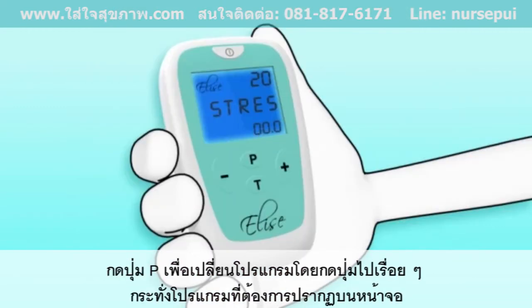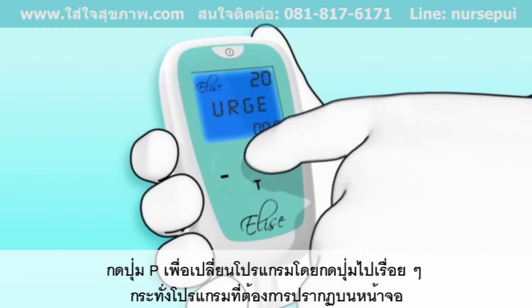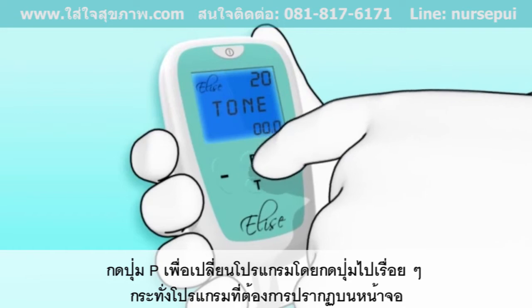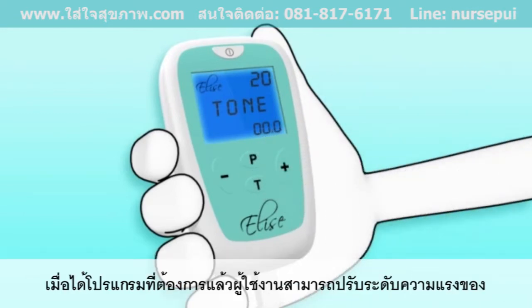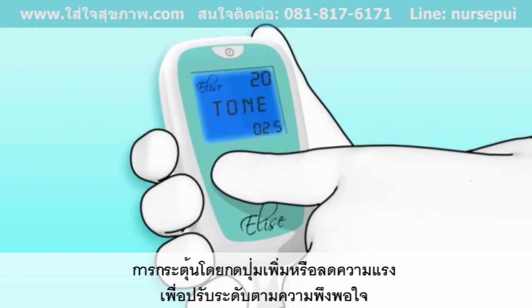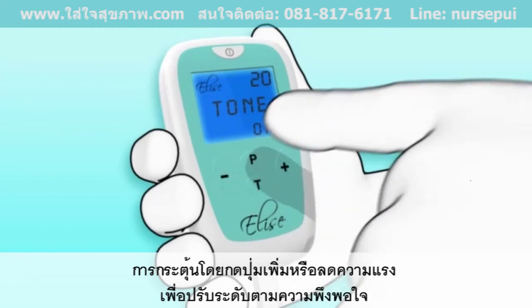To swap between the programs, press the Program button, which is labelled P. Keep pressing and releasing the button until the program you want is displayed on the screen. With the required program selected, you can now adjust the intensity of the muscle stimulation by pressing the Strength Up and Strength Down buttons until you reach a comfortable level.